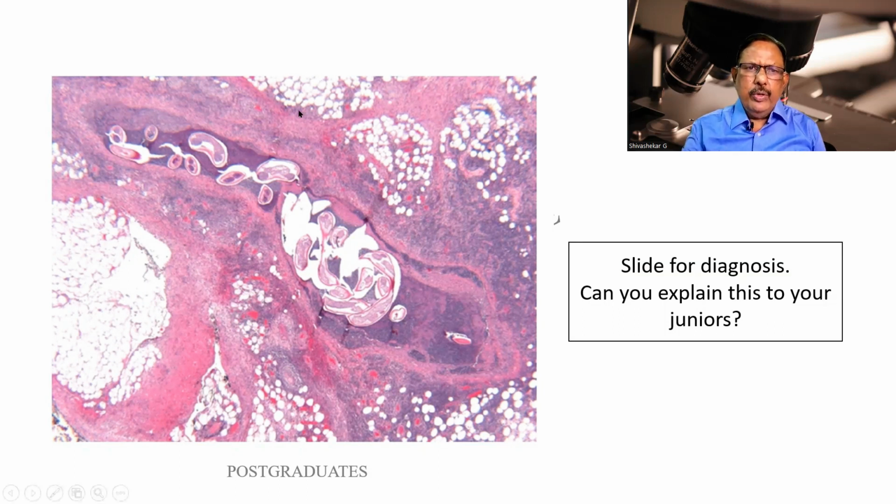I am able to make out a fatty tissue. Multiple small dots are over here, attempted aggregation. So probably these are all lymphoid follicles. The pink or the eosinophilic one might be the connective tissue, and there is a perinodal fat. Also, I am finding a space within which multiple linear as well as oblique cross sections of something is seen.